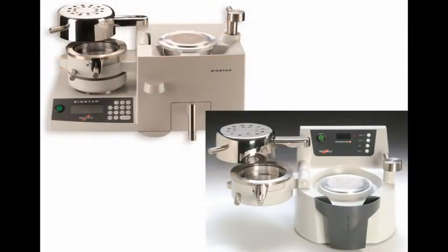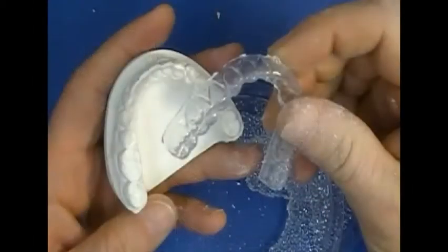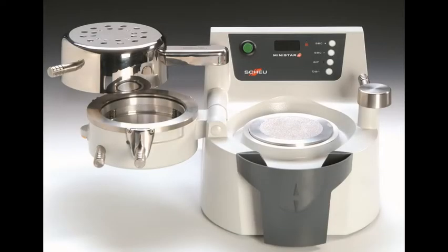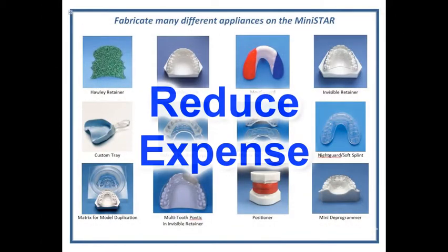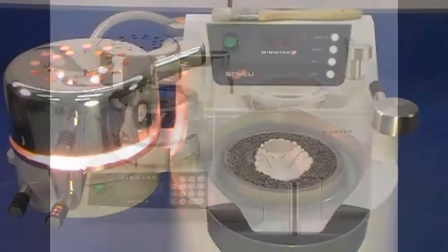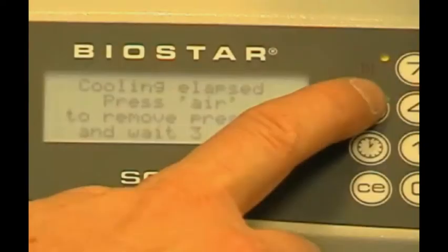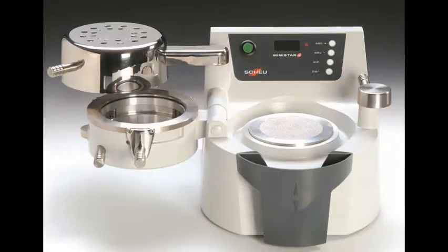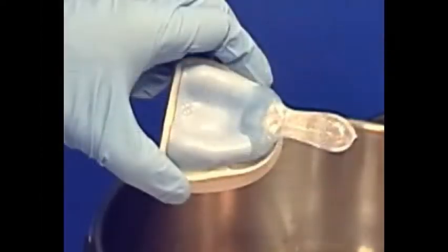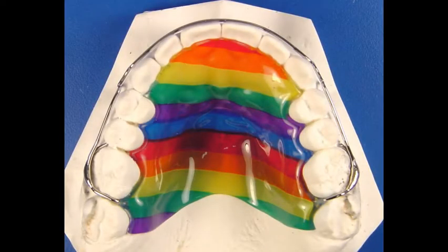The MiniStar and BioStar use positive pressure, which gives you superior adaptation to your model, ensuring the accuracy and fit of your appliance. These machines can significantly reduce your lab expense by increasing the variety of appliances you can do in-house. Most of the technique videos in our Resource Center feature the BioStar, because that's what we use in our commercial lab at Great Lakes. For most dental practices, the MiniStar is ideal. You can use the MiniStar to fabricate the same extensive variety of appliances that you can with the BioStar.